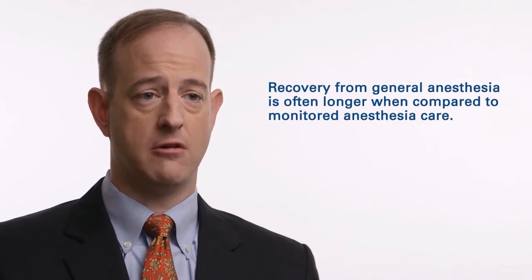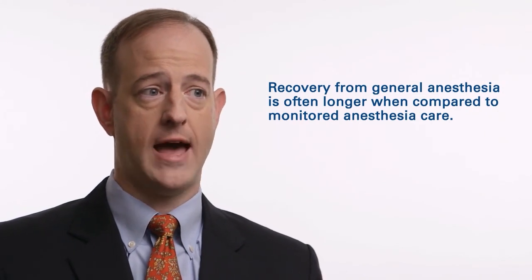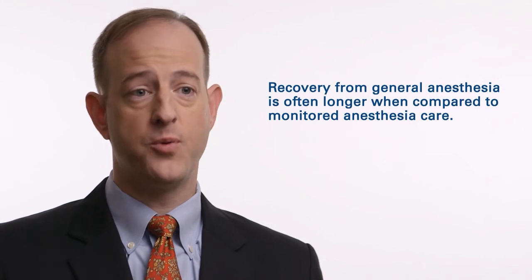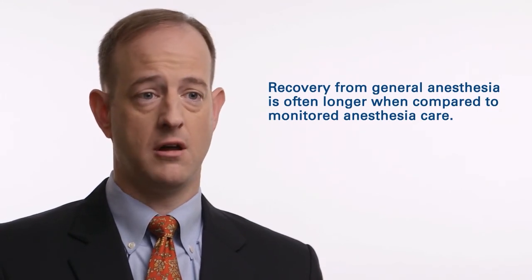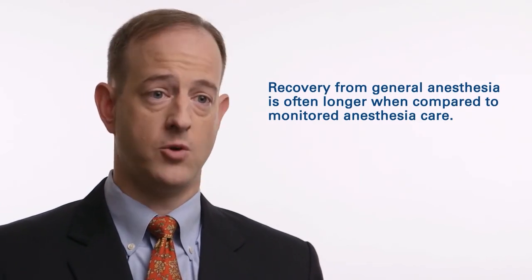The recovery from general anesthesia is often longer, and the concern that patients are not appropriate for discharge because they are still under the lingering effects of general anesthesia could make one consider keeping someone overnight, whereas moderate or MAC anesthesia often wears off much more quickly, has very few hemodynamic effects, and leaves patients in a position where they can participate in that decision-making process in the post-operative setting about whether they feel comfortable going home.